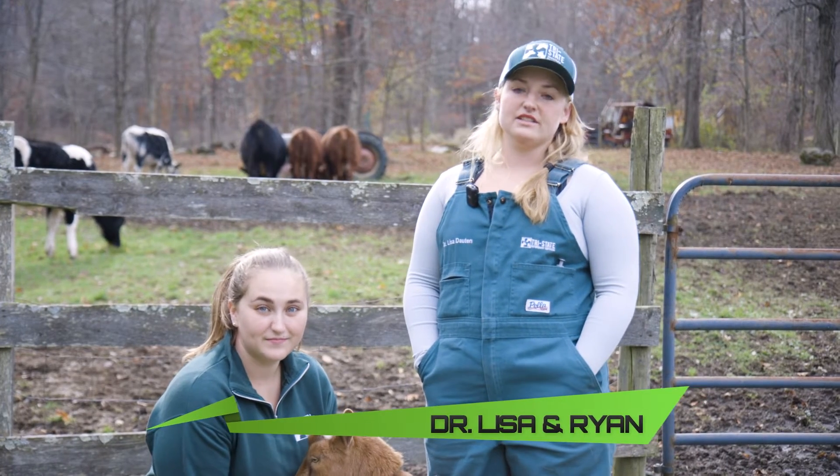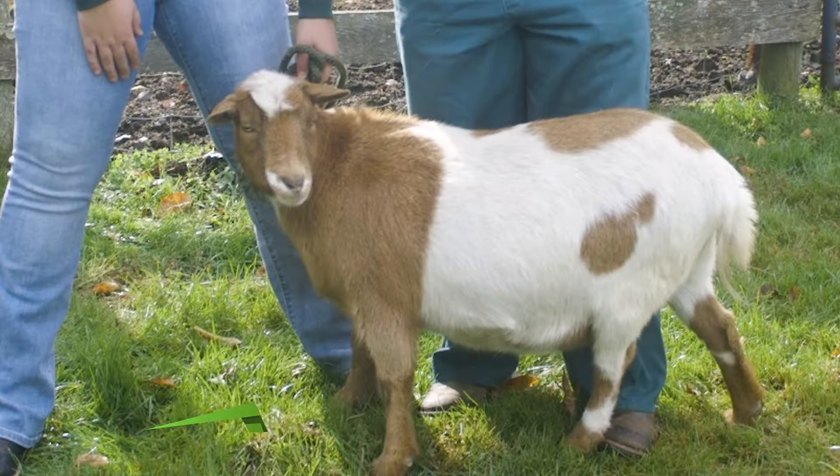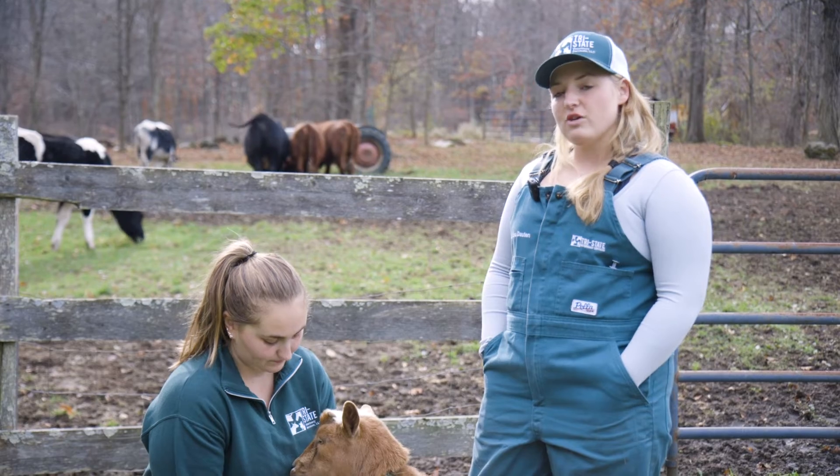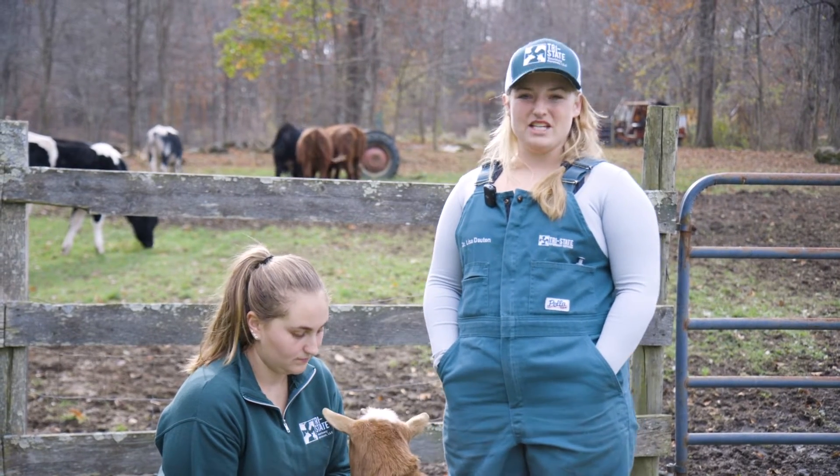Hi everybody, I'm Dr. Lisa with Tri-State Veterinary Services and this is my assistant Ryan and Jerry the goat. In this video we're going to go over giving intramuscular or IM injections.